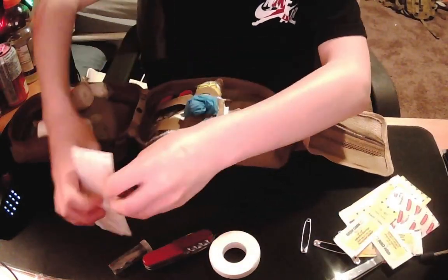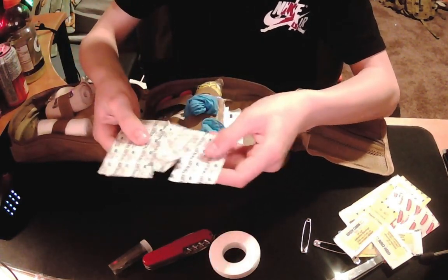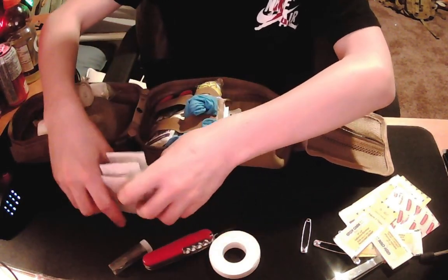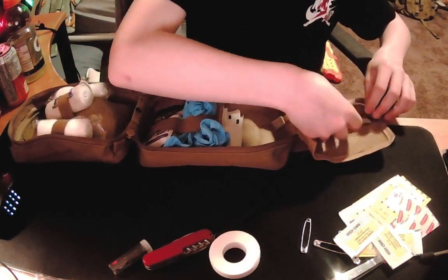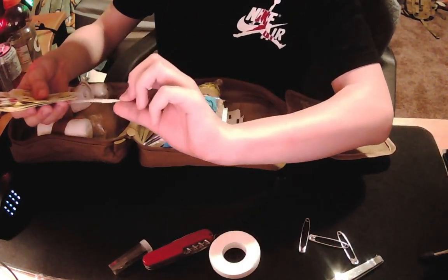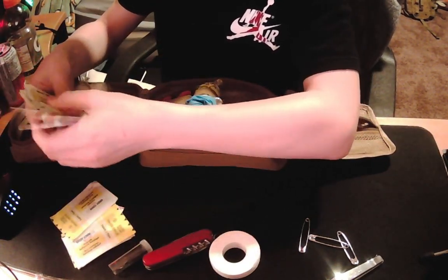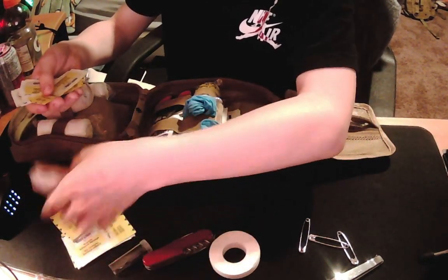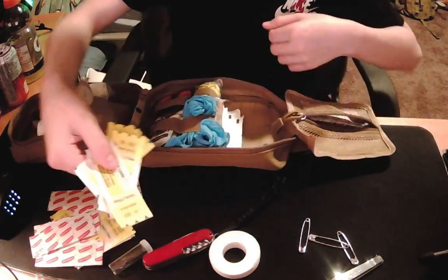These are kind of like gel bandages for blisters, for second degree burns and stuff. I have 10 of them total, all different sizes. Then here I just have various sizes of band-aids — two small ones, a bunch of big waterproof ones, and some random ones that came with the little first aid kit that I bought.